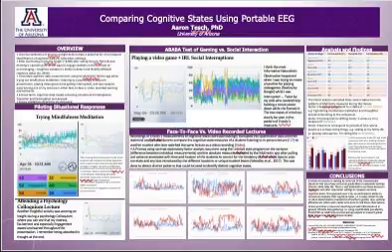So they have a measure of stress, a measure of excitement, a measure of engagement, a measure of focus, a measure of interest, a measure of relaxation. And since this is a brand new thing to me, I wanted to see if these measures actually could be validated in real life situations.